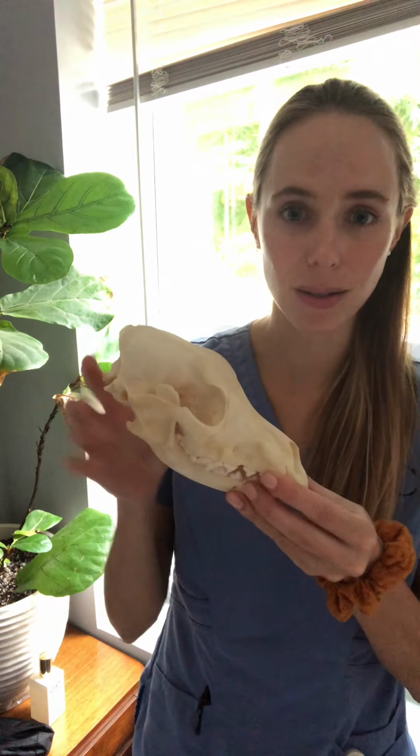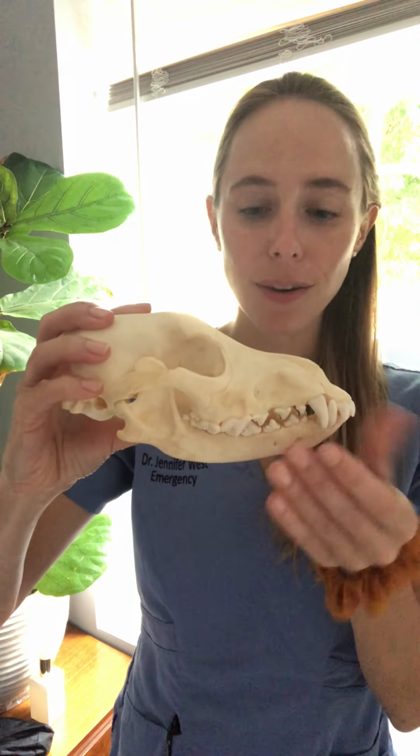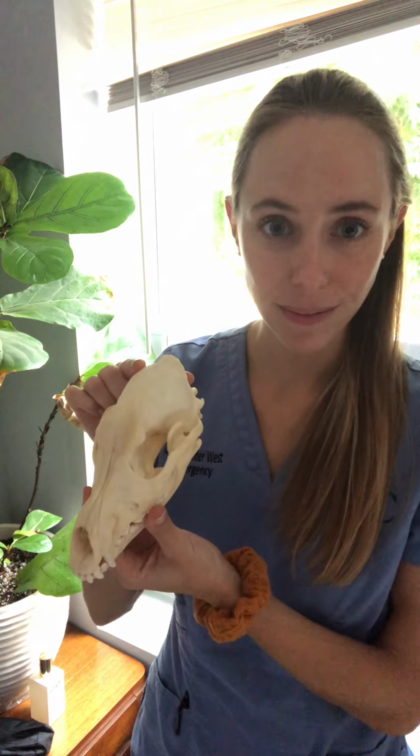An X-ray can't go through bone very well. So things like the skull, so we have an entirely encased brain in a dog's skull. If you take an X-ray of this skull, a lot of things are superimposed on top of each other. You can't see what's inside here, the brain.